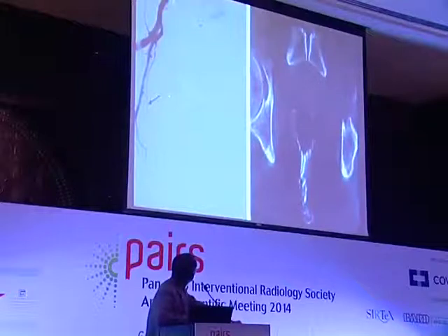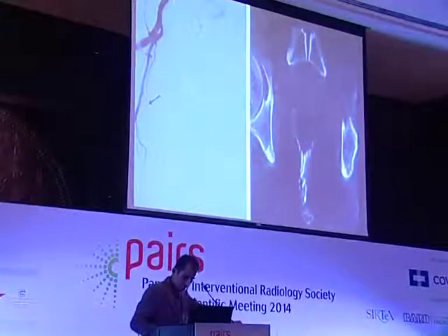Another patient who had what was thought to be the inferior vesical artery on the right side, prostatic branches, although there is no supply of the prostatic gland. Injection of contrast, and then cone beam CT shows that this is not the inferior vesical artery. As a matter of fact, this is the inferior rectal artery, and there is contrast seen in the rectum.